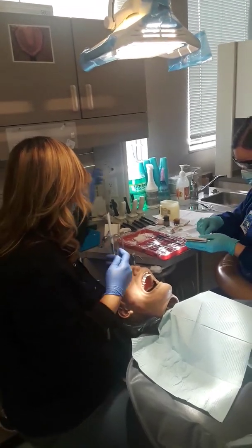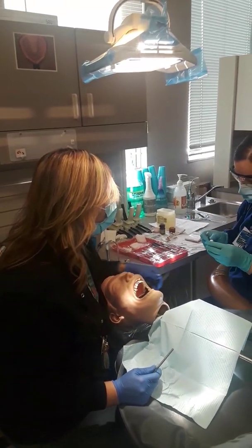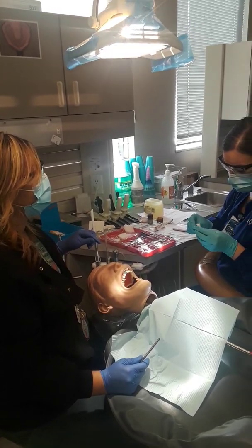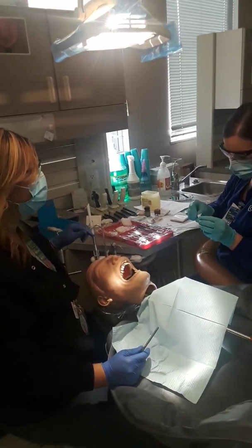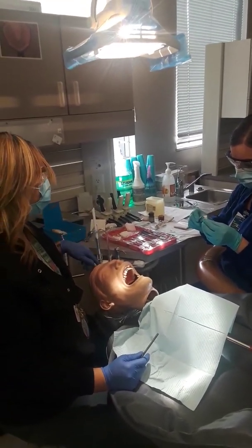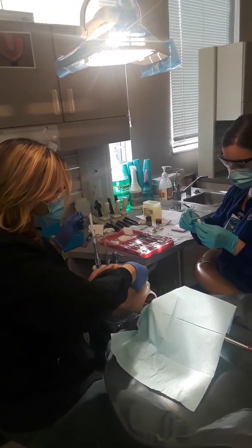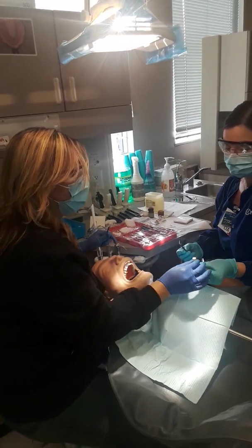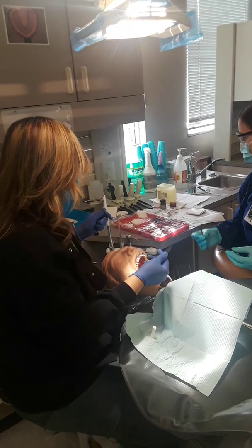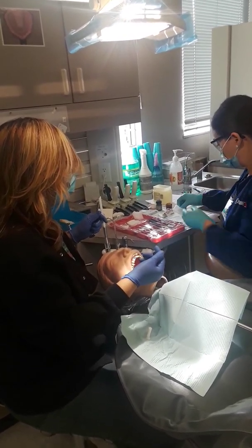Go ahead and add it to my crown. In this case, we don't add it to my crown because I really don't want to temporary cement Dexter. So she's going to add it to the end of a cotton roll. Smooth it on like butter. Now, if you like a lot of butter on your toast, you're going to be cleaning a lot, because once I push that crown in, it's going to squirt out. So just a little bit of butter. She's going to pass me a crown with the cement inside, but we're pretending here like we have cement inside.